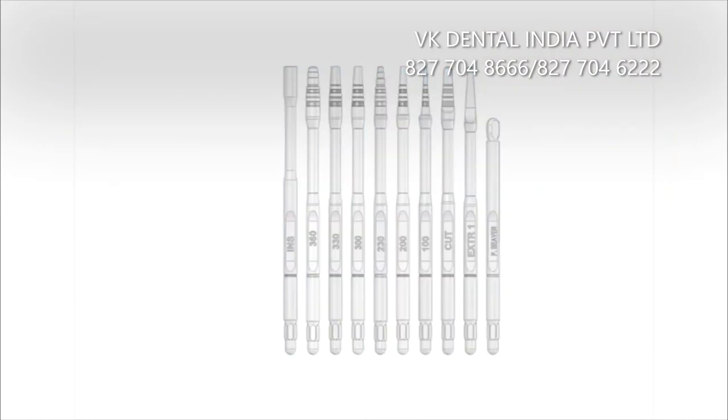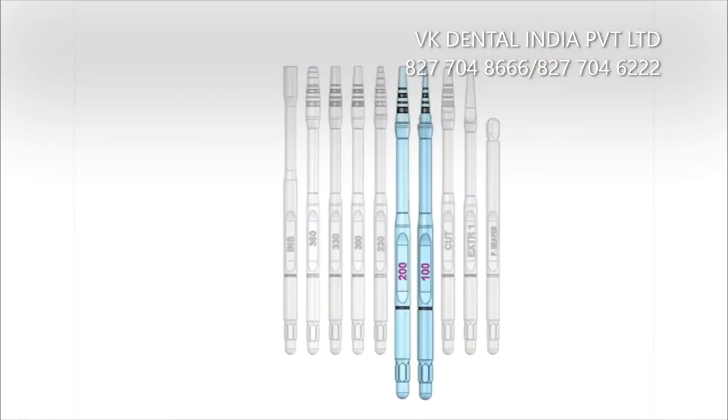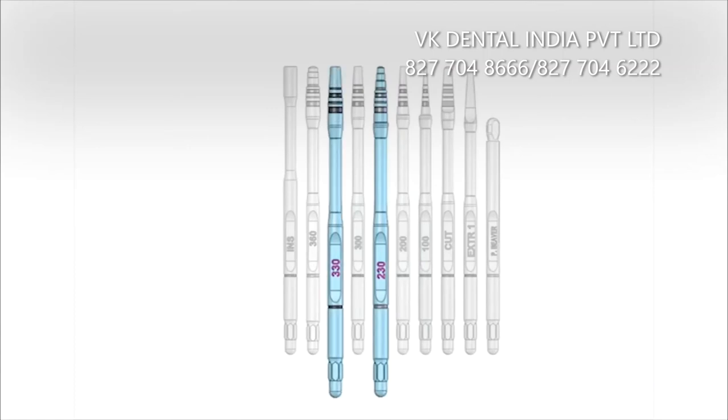The kit includes osteotomes in 1mm, 2mm, 3mm sizes, and a bone expander for the implant site diameter expansion.